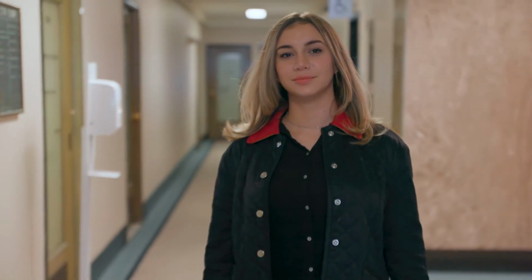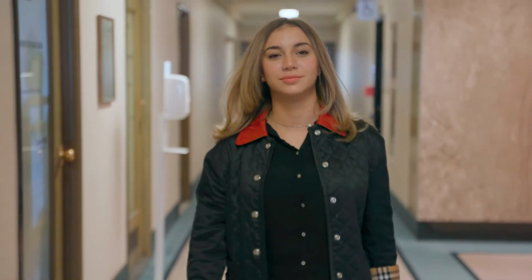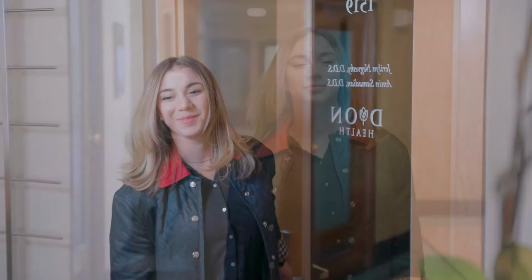So a good candidate for LANAP procedure is who has periodontal disease that is more than what we can achieve with scaling and root planing, which is the deep cleaning. So any pocket depth that is more than 6 millimeters, we always treat with LANAP.